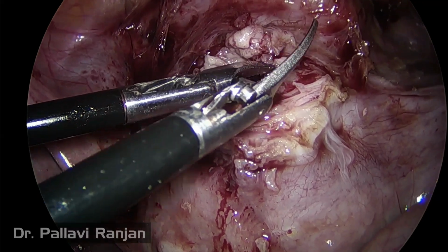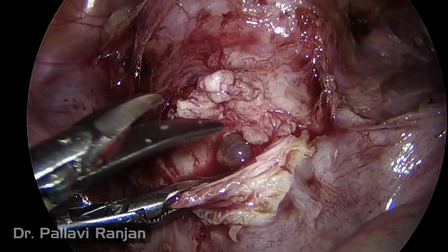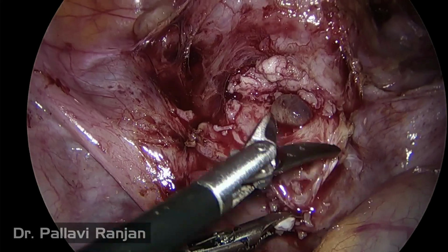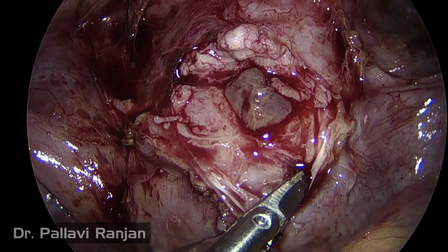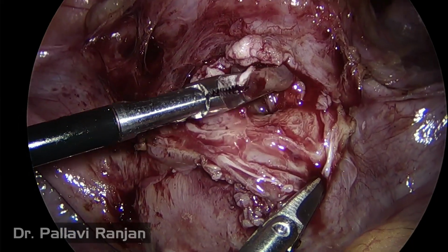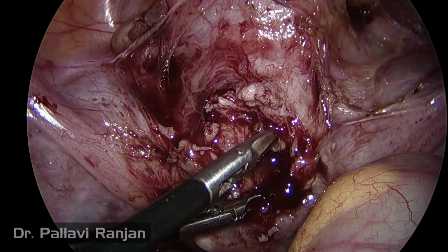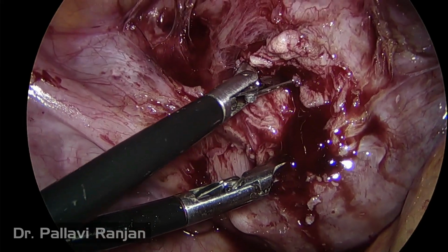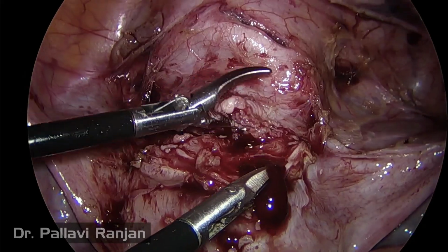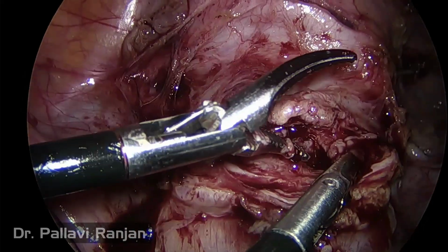So this is the fluid filled sac which is coming out, and one can remove it directly. After the removal of the sac, one has to do adequate suctioning so that the remaining chorionic tissue is removed, and we have to extend the scar now so that we can refreshen the edges of this scar which we have opened.